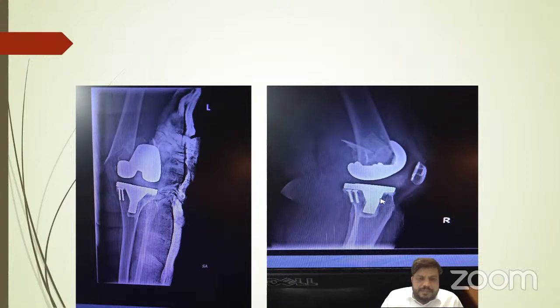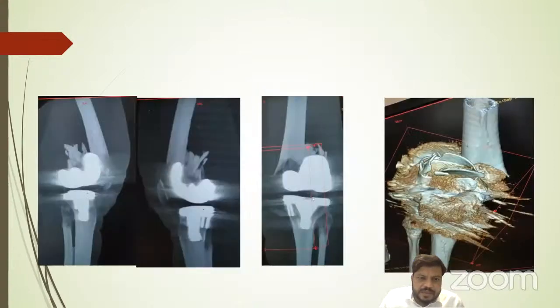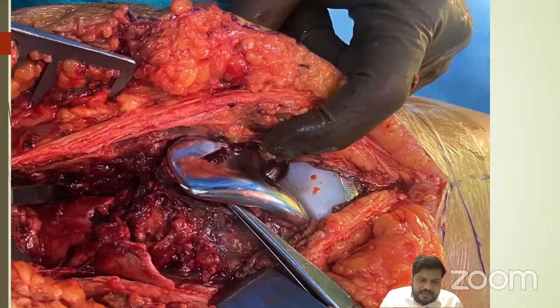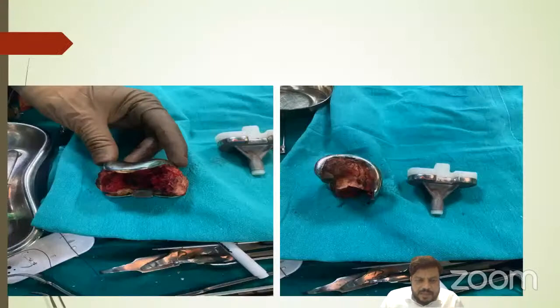Type C, yeah. So though we have good locking plates for fixation, sometimes it is not possible to get proper bone stock and a good healing potential. So I just did the same thing. I did an extended approach, and when I assessed the fracture, the femoral implant was a little loose and moving. So when I removed the whole implant, there was very minimal bone left.